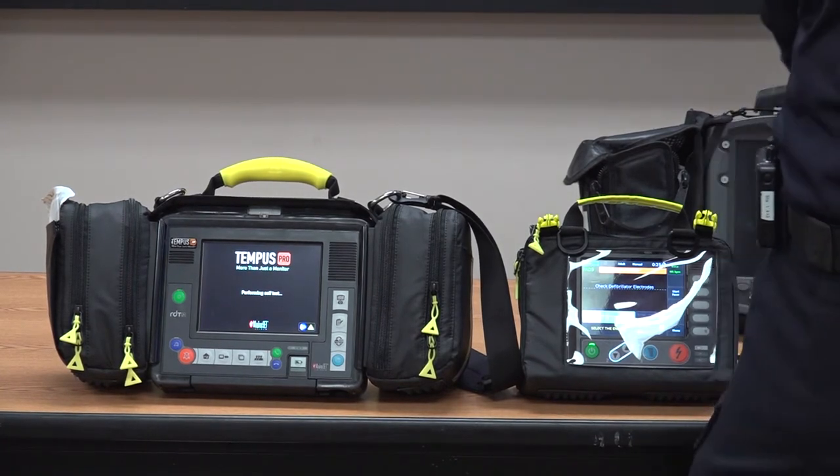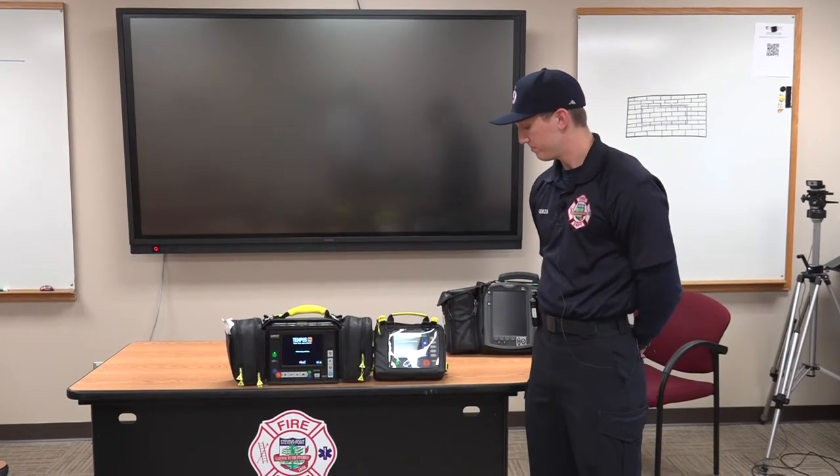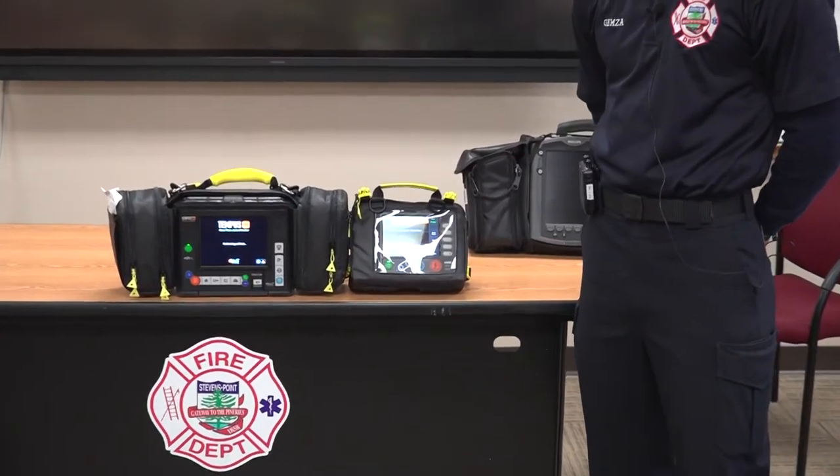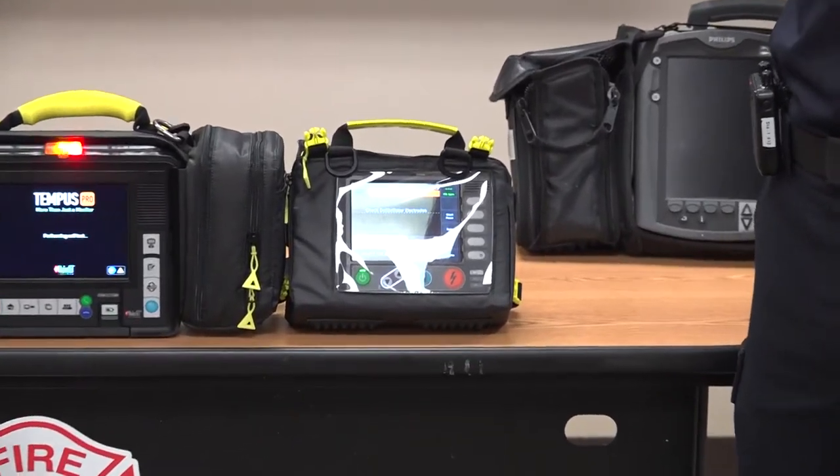As you can see the defibrillator has come up here. The defibrillator has the ability to defibrillate obviously, as well as pace and cardiovert.